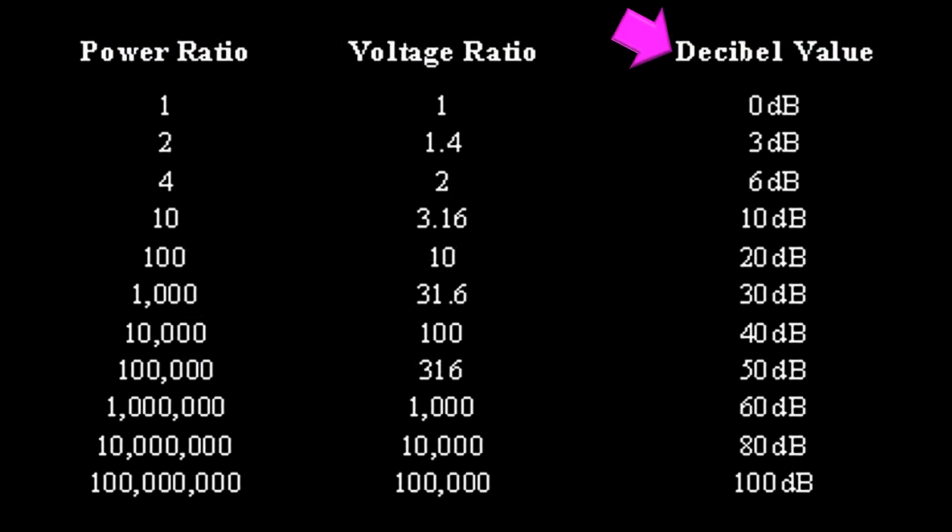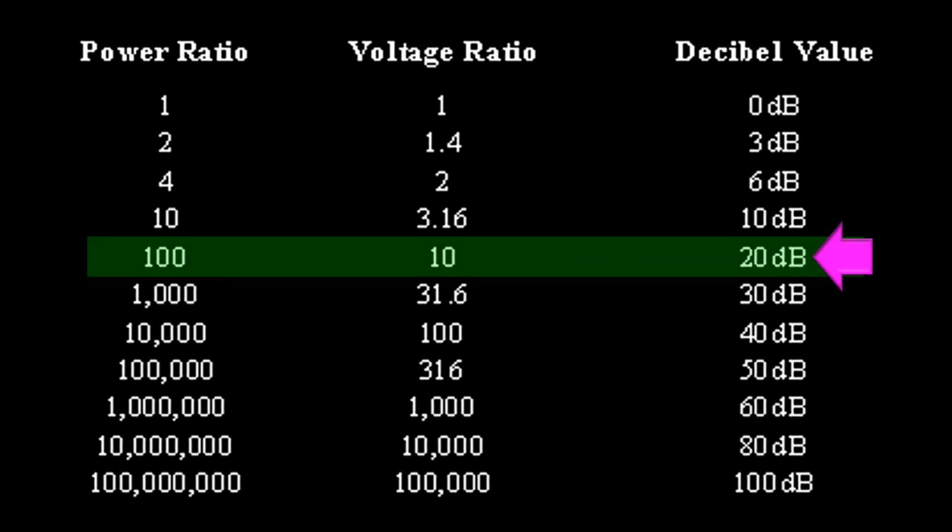dB is a funny unit. It has a different connotation when used for voltage than when used for power. When referring to neurodiagnostic testing, it is usually used for voltage, but this is not so all the time. So 20 dB gain corresponds to a 10 times increase, or a gain of 10 times.